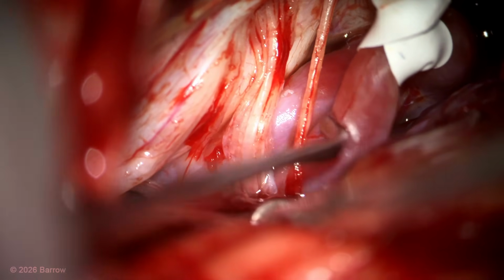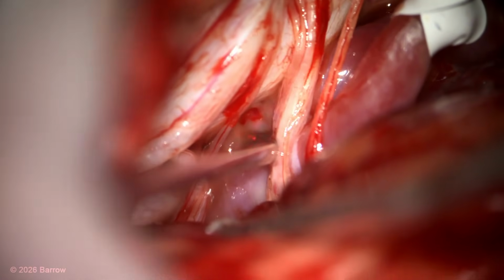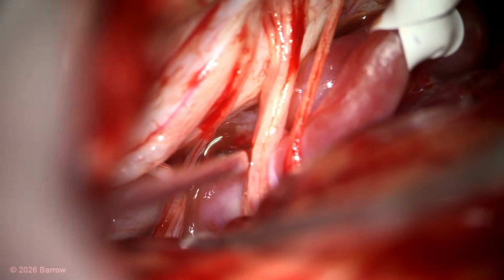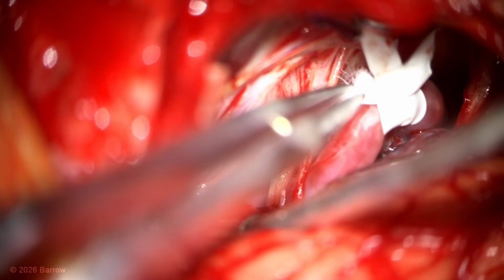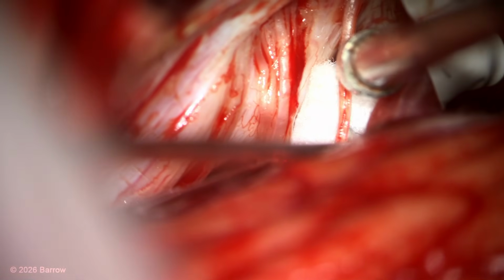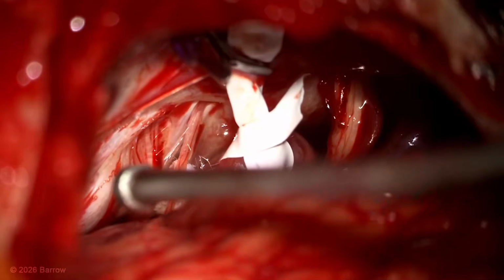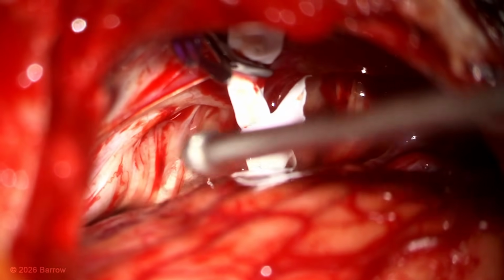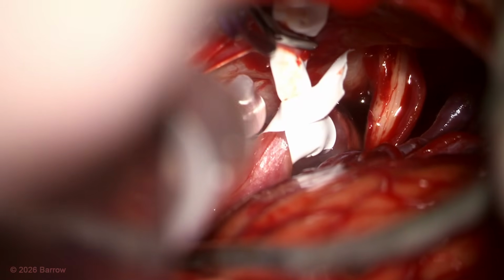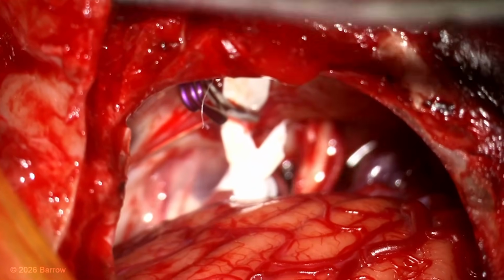So the ipsilateral V4 segment is nicely mobilized, but you can see how the contralateral V4 is still compressive into the 9th and 10th nerves. Therefore, I push the artery more medially, and I'm placing this Teflon pledget between that artery and the 9th and 10th cranial nerves. Now there is no contact from the right V4 segment on these nerves, and fibrin glue anchors that Teflon pledget. Here is our final construct.